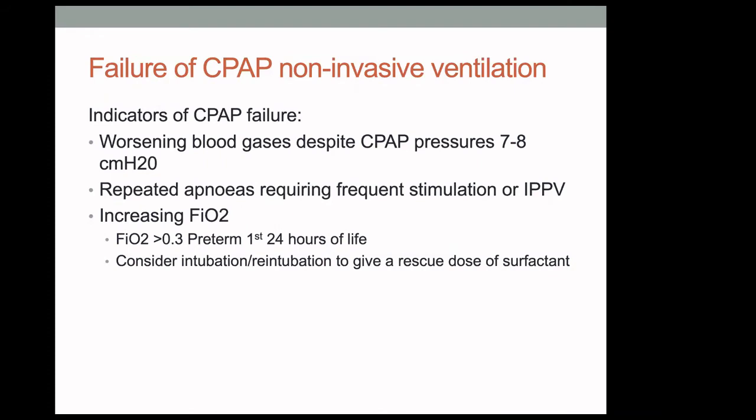So how do we tell whether or not CPAP's working? There are some indicators of CPAP failure, and these are worsening blood gases, which would show a respiratory acidosis despite adequate CPAP pressures. And on the ventilator, you can see how much CPAP pressure you're achieving.